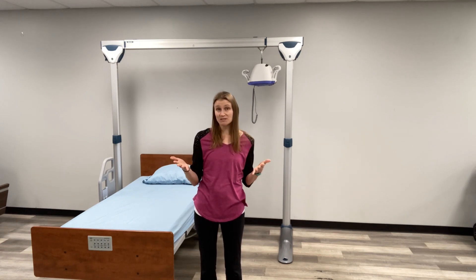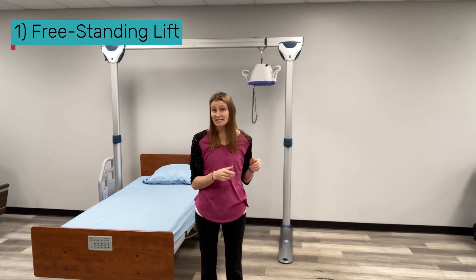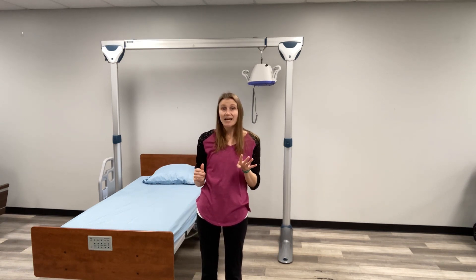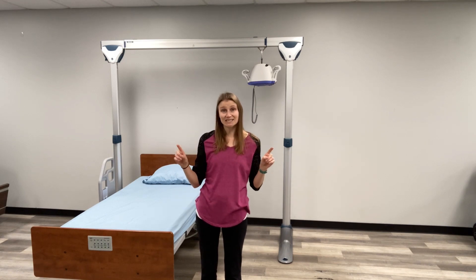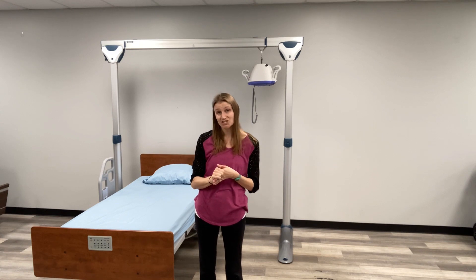There are three types of overhead lifts. The one behind me is a freestanding lift. These types of lifts stand on anywhere between two and four legs. They are rental property and retirement community friendly, as there are no nuts, bolts, or screws into the floor or the ceiling. You can put them up, take them down — there's no damage to the carpet, no damage to the ceiling.